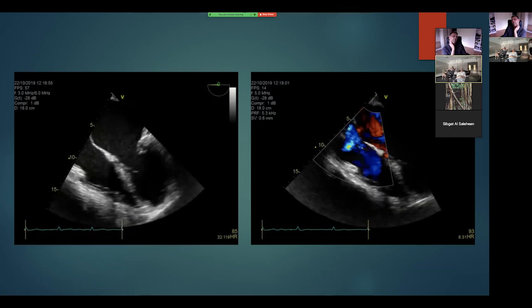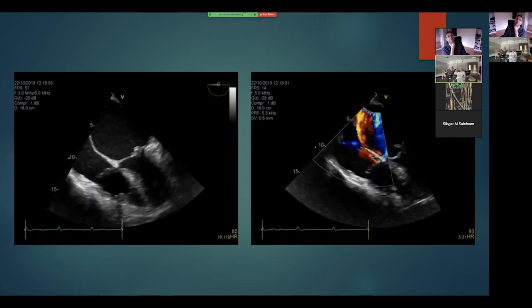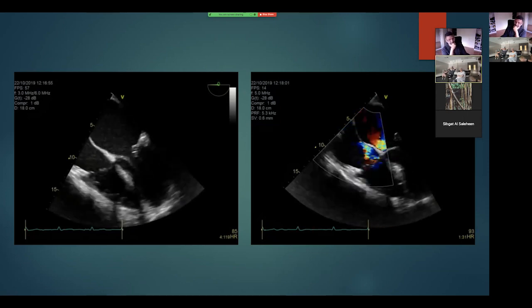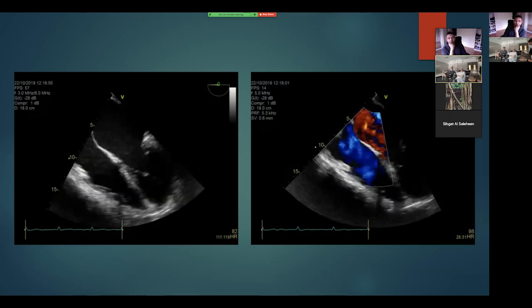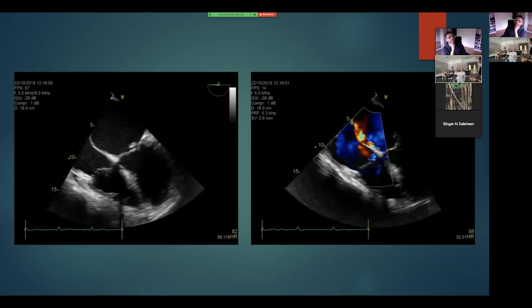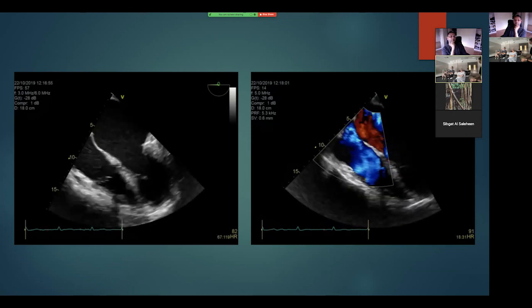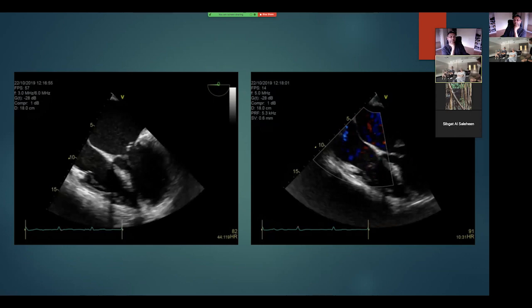And maybe just a good point for the exams: you've got to say what you see. You can't overreach. For reporting echoes, you've got to be relatively conservative. You've got to say what you see, but you also can't sit on the fence. We can't say mild to moderate or moderate to severe. Sonographers are allowed to do that when reporting, but we have to make a call.